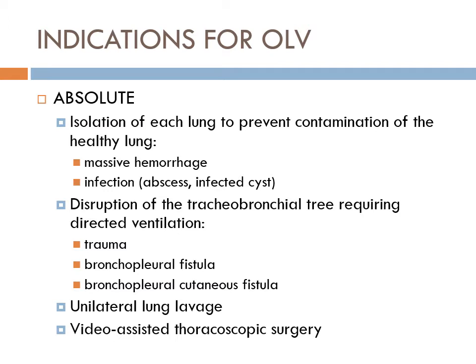So you put the train of 4 on. Some of the train of 4s have a constant twitch, like every couple seconds, it's just going to twitch, twitch, twitch. And what do you think happens with non-depolarizing agents? Twitch, twitch, twitch, twitch, right? You start to lose that amplitude and that thumb adduction. You have what's called fade. You sometimes lose all your twitches depending on how much you're muscle relaxing. So where I'm going with that is that we do certain things to help make other people's lives easier.